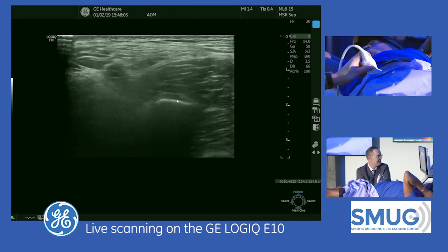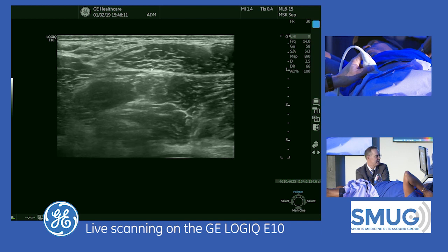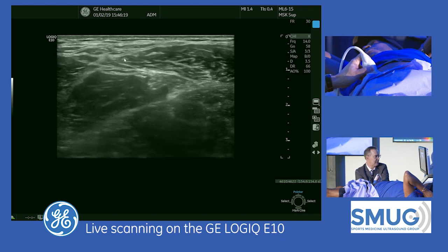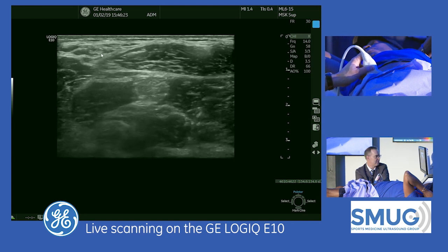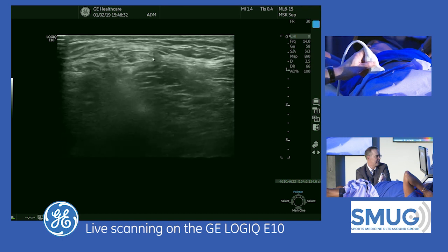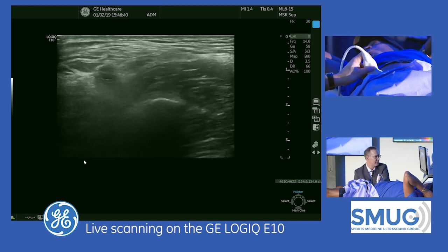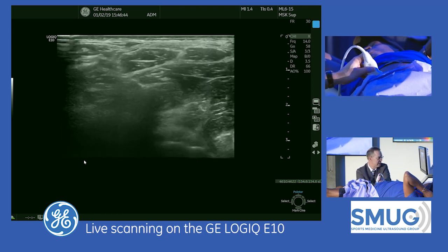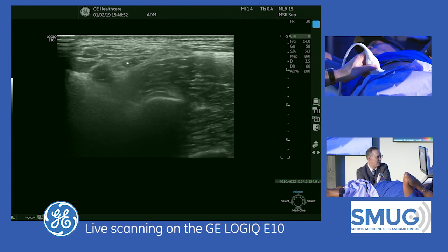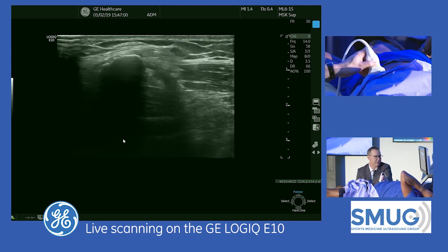Going more distally, the nerve courses medial to lateral over the sartorius. There's usually a fat triangle at the lateral margin of the sartorius, and there always seems to be one fascicle sitting in that fat triangle. If you're having trouble seeing it, go down to the fat triangle, find one fascicle, then follow it up as it reconstitutes with other nerve fascicles. The three-step approach: start at the inguinal ligament, look over the sartorius laterally, and look in the fat triangle. There is variability — it can go under, through, or around the sartorius or anterior superior iliac spine. That's how I approach the lateral femoral cutaneous nerve.